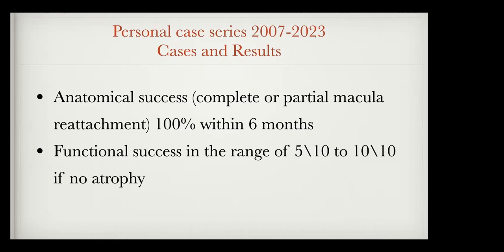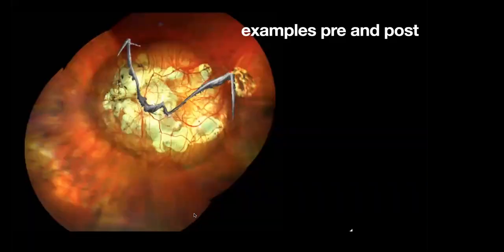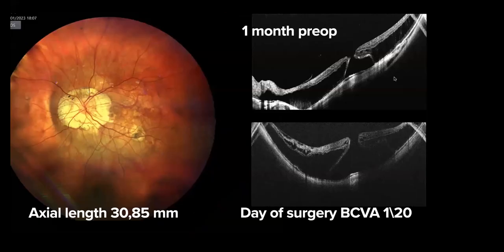The functional success is limited, of course, by the amount of atrophy, or if the patient has amblyopia, anterior media, many different factors. But the anatomical success is guaranteed. And I can show you some examples here of pre-op. You see, I checked this patient 1 month preoperatively, and then in 1 month she had already gotten worse.